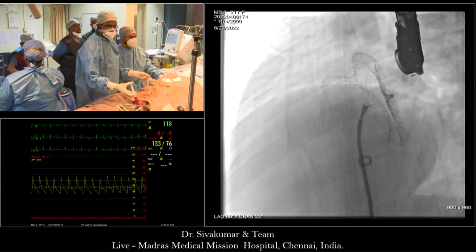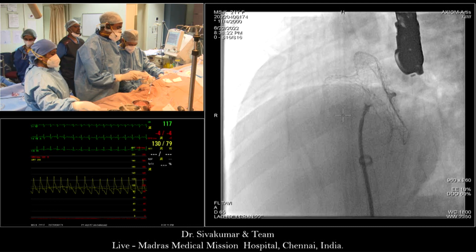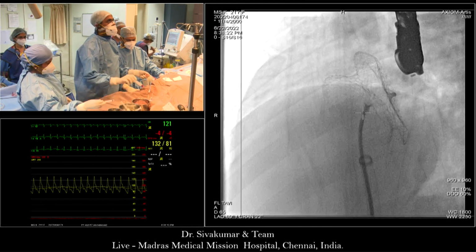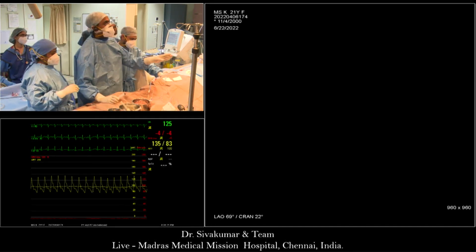Okay. So most people are saying the waist is not fully formed yet. Siva, what do you mean? If the waist is still constrained, then you may have oversized the device. The device seems to be touching the mitral valve. No, forget that. The mitral valve is a separate issue. But even if it wasn't touching the mitral valve, go more leftward.